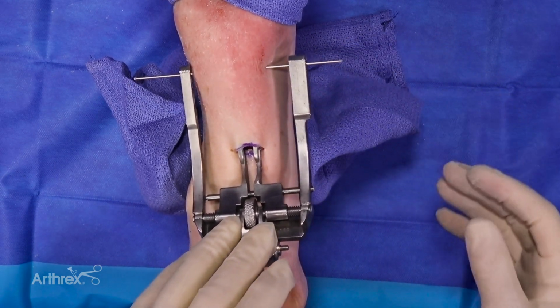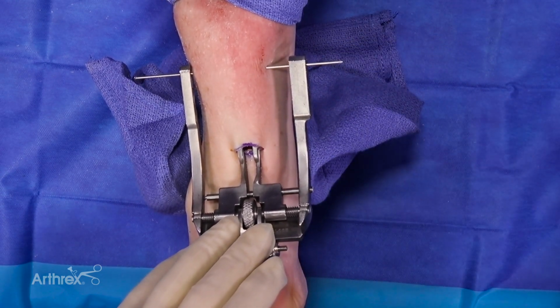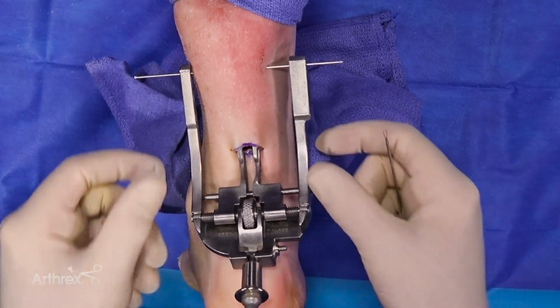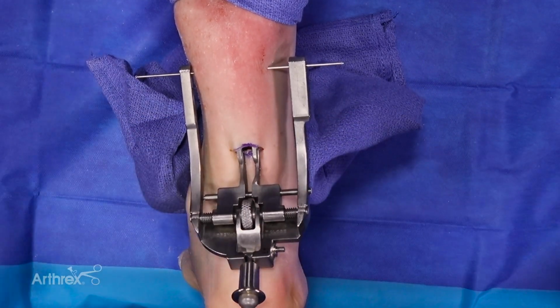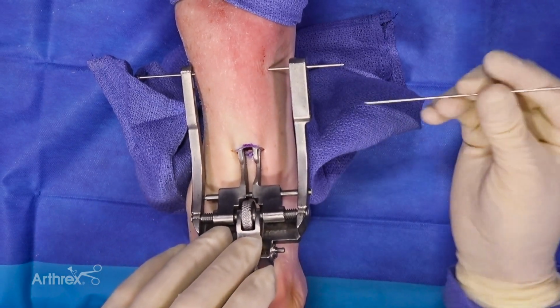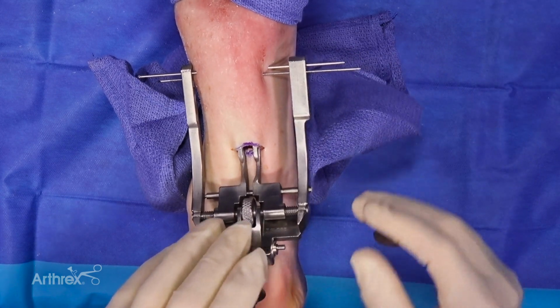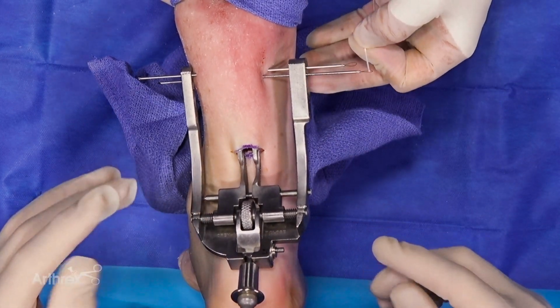So we'll go in position number 1 right here, and we slide through. These needles were developed so they're not so sharp as to cut through a nerve, but they're sharp enough to get through the soft tissue and the integrity of the Achilles tendon itself. So now my first needle is there and it stabilizes the device. Now what I'll do is I'll go ahead and put my second one.